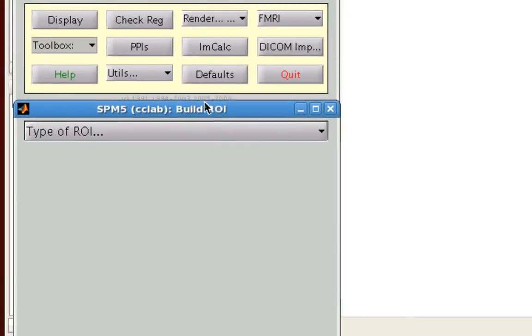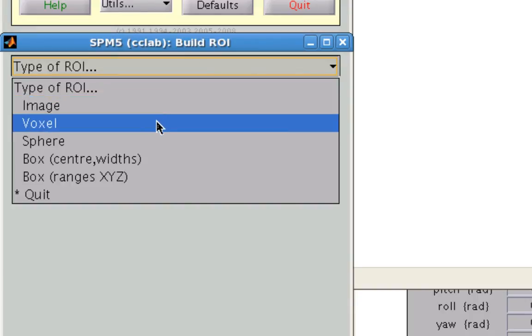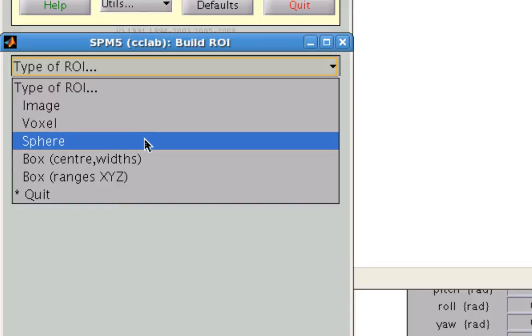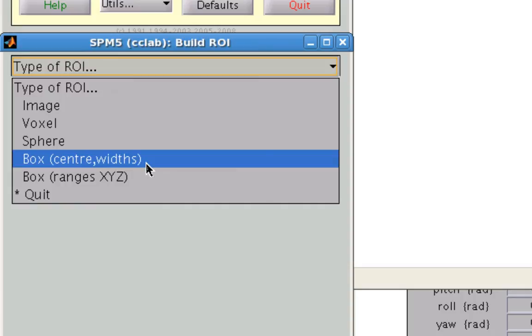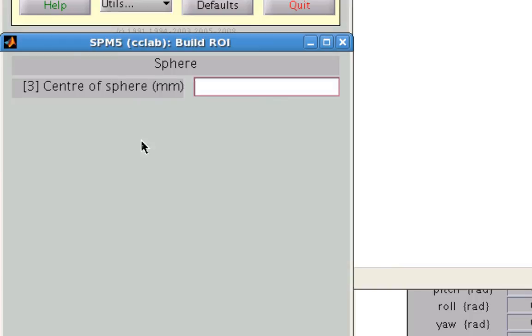So here you can see that we have different types of ROIs that we can create. For example, we might just wish to focus on a particular voxel, we might want to create a sphere centered around a particular coordinate, or create boxes also encompassing certain clusters of voxels. Here we're going to focus on one of the most popular types of regions of interest, which is the sphere. So go ahead and click that.